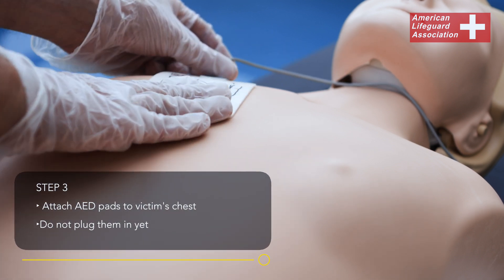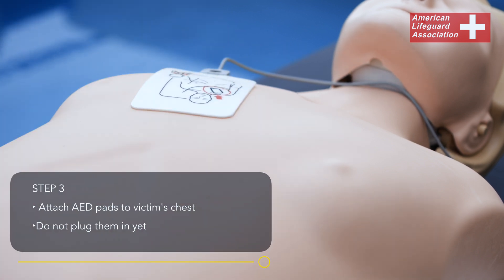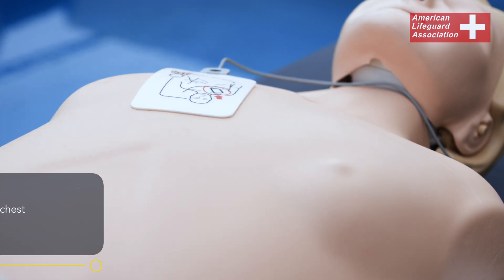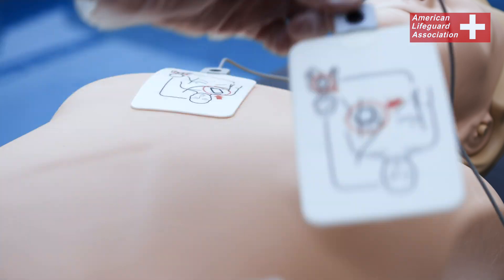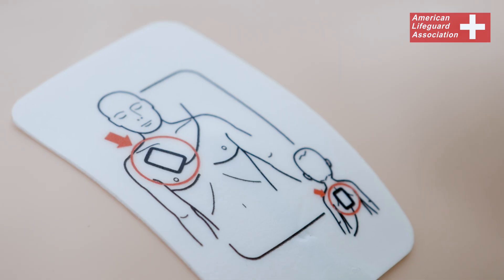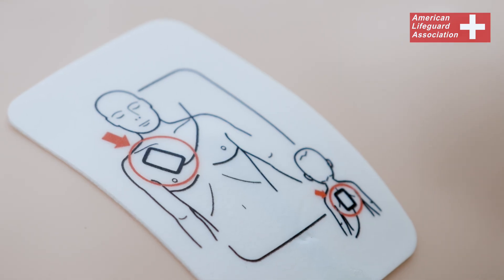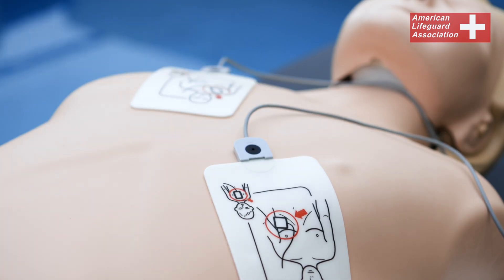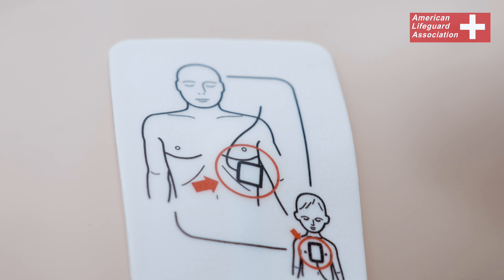Attach the AED pads to the victim's chest without plugging them in yet. For adults and children, place the first pad on the upper right side, and the second pad on the lower left side of the chest.